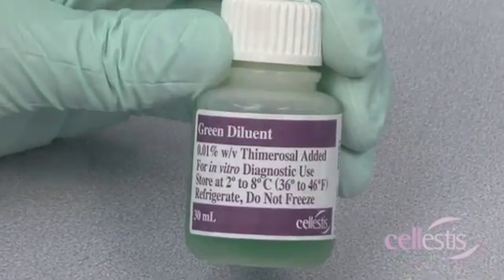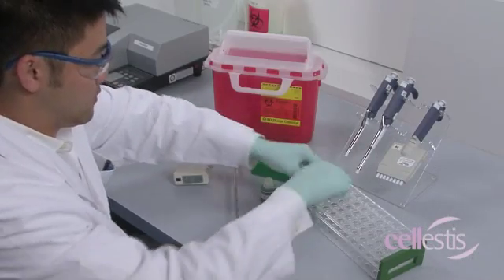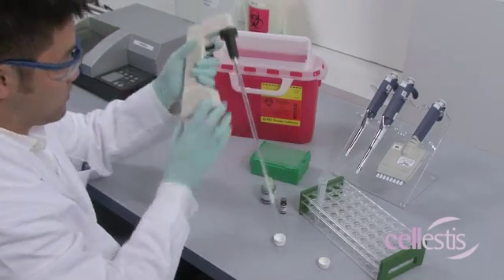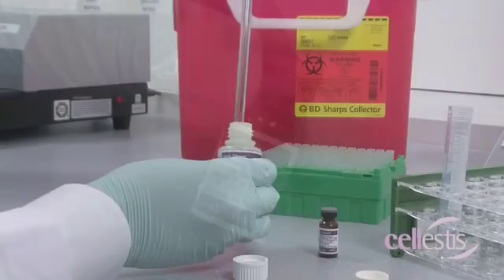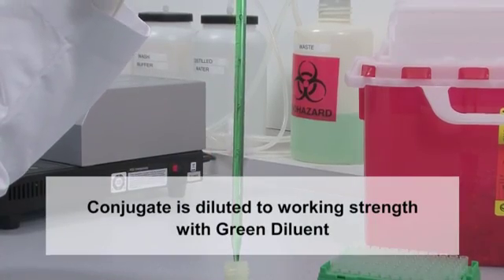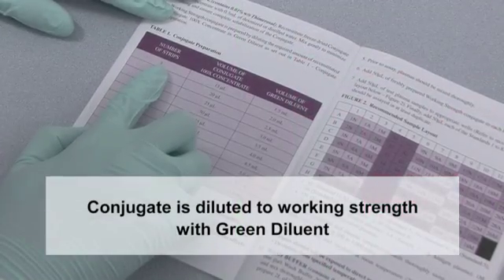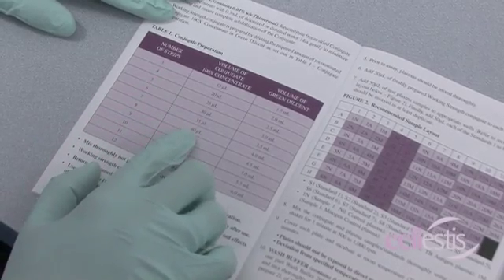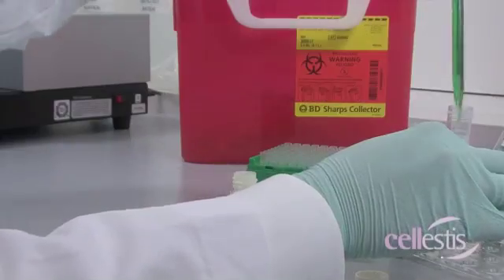Prior to performing the ELISA, sufficient working strength reagents need to be prepared. The conjugate is 100 times concentrated and needs to be diluted to working strength using green diluent. The package insert indicates the appropriate volumes to be prepared for the number of ELISA plate strips required.